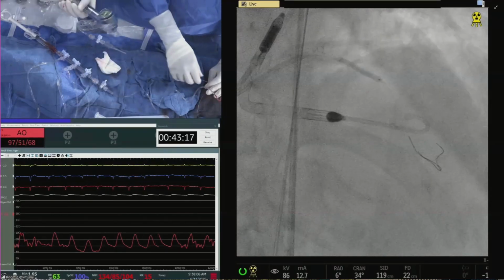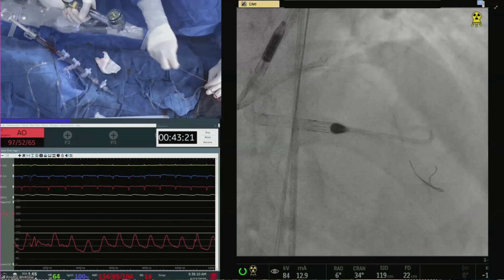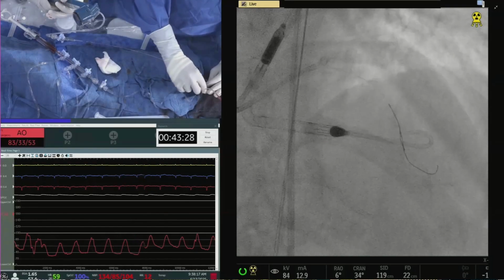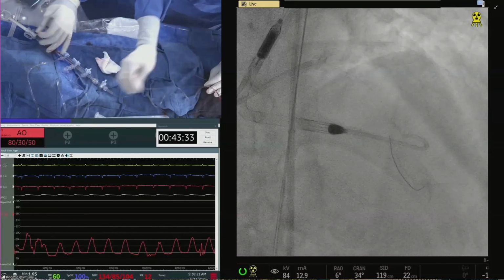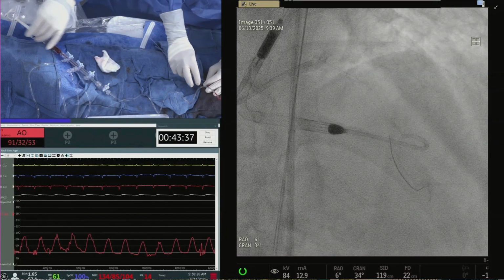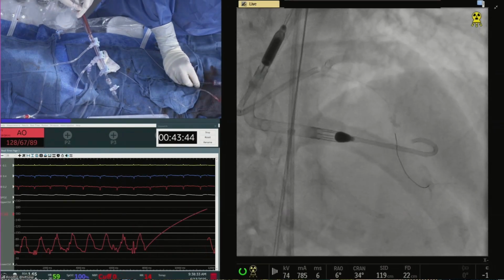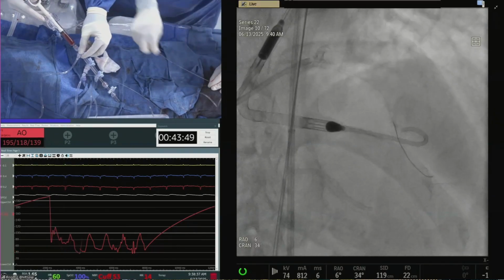Okay, down. Now get the Fine Cross again. Watch your distal wire there. Watch your wire, watch your guide. The LAD is a very retroflex bend. You want the Fine Cross. I'm taking the rotor wire out of the diagonal and taking a picture. Let us see what we have done to the LAD. Is it there still? It'll be there. Okay, go. See? Okay. Give the Fine Cross again.